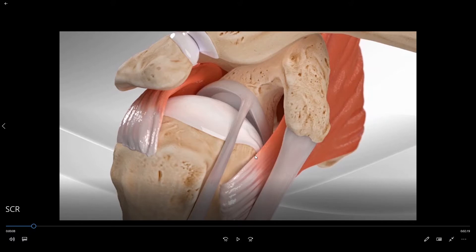The unique thing about a superior capsule reconstruction is that, as in this model, you have a rotator cuff tear whose tendon has retracted so far back away from the ball that it is unable to be pulled back to the ball and reattached. In this particular model we see that we have the subscapularis tendon in the front of the ball which is attached. We have the infraspinatus tendon which is attaching to the back of the ball, which is attached and looks normal as well.